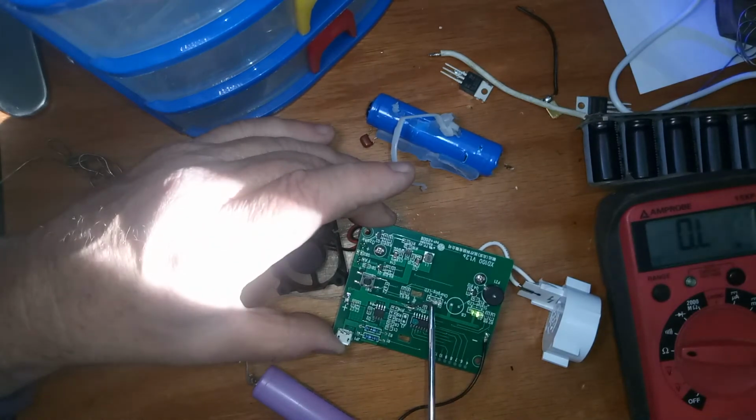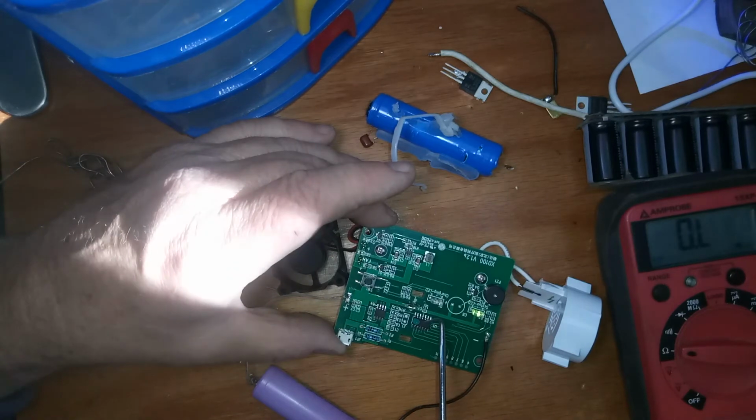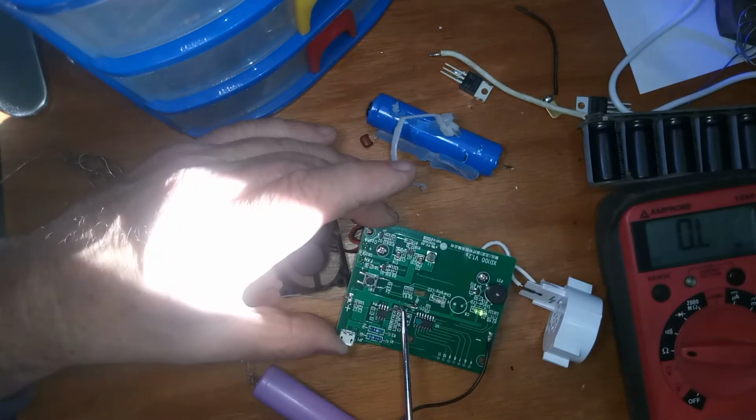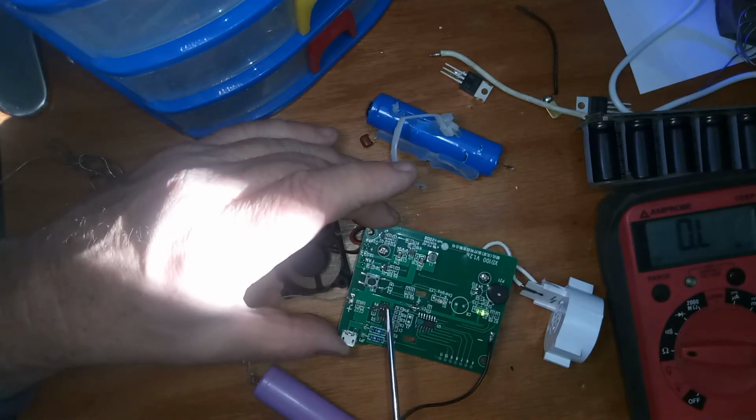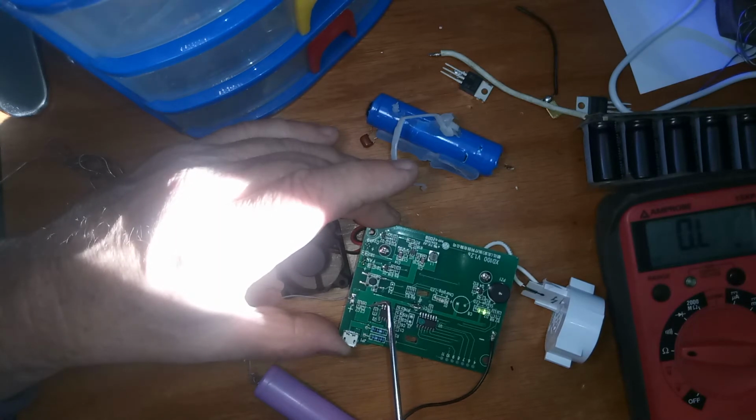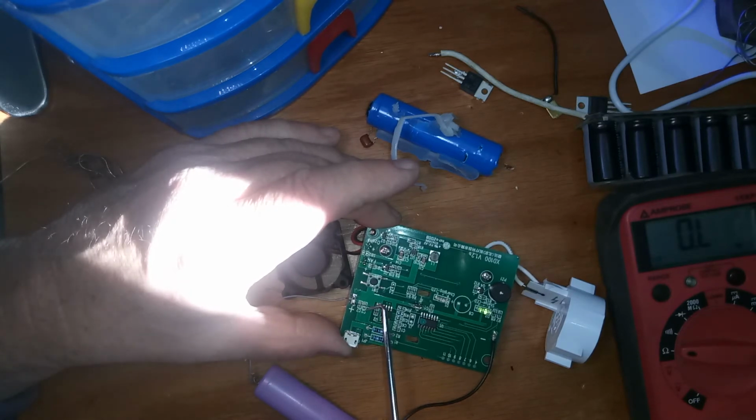But like I said, first I cut this break here, and so I knew it wasn't this part of the circuit. And then I knew that, okay, it had to be this or these two capacitors. These little capacitors short out now and then. There's a far higher failure rate on these than regular capacitors. And like I said, I just took a chance. You heat these up, you pop them off. I'll bridge in another little capacitor here before I put it all back together.